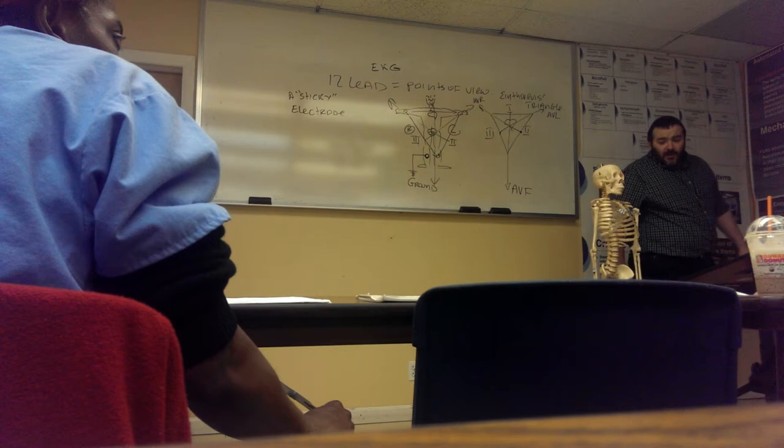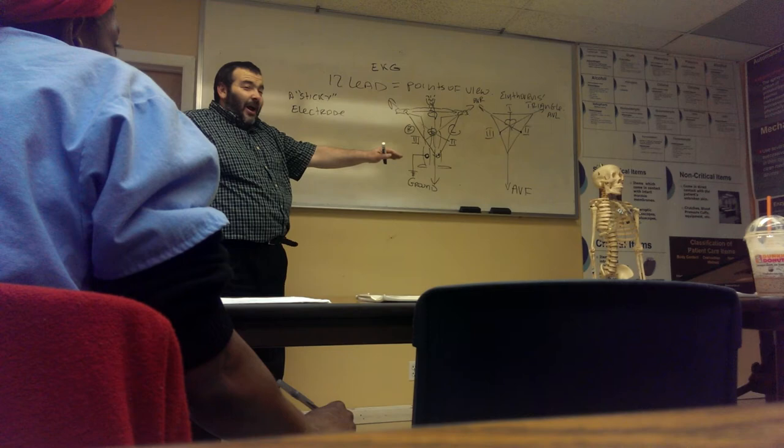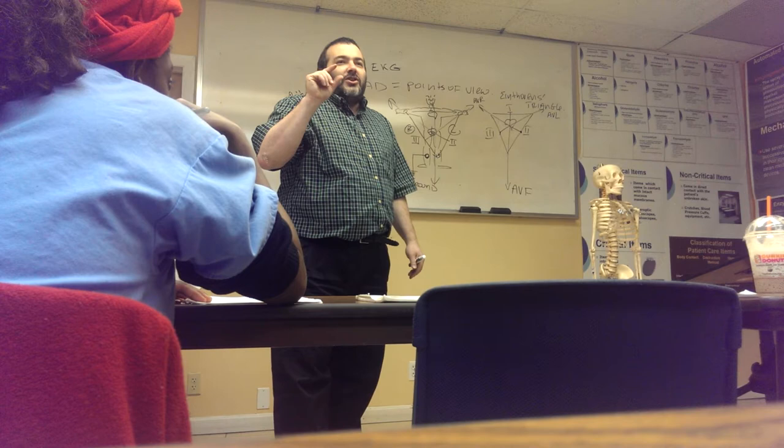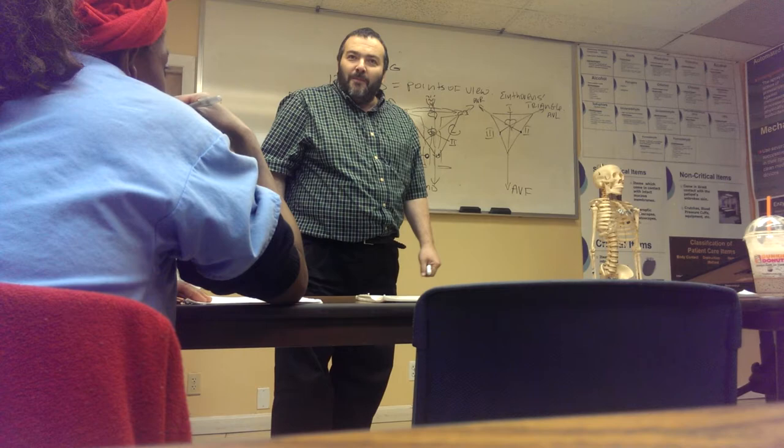Don't you see that? It's like I'm checking out the heart. My first date with a heart, and I'm checking it out from every possible direction. Right? Does that make sense? Folks, I'm only giving you a little bit of information. You don't need to know more, but you do need to know what AVR, AVL, and AVF stand for, because it's going to be on the test.